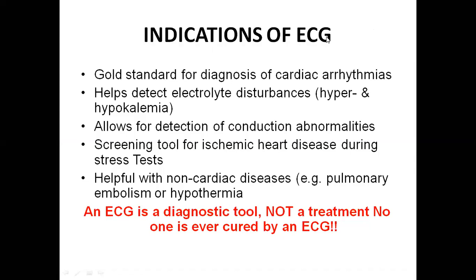Though this ECG, firstly, if you have seen any kind of video of ECG or EKG, you can remember this. Some wires and some connections were made on the skin of the human body, and also a machine is connected at either end of the wires. So this wire is nothing but the connecting wires. These connecting wires take the action potentials from the human body and show them on the machine, the ECG machine.